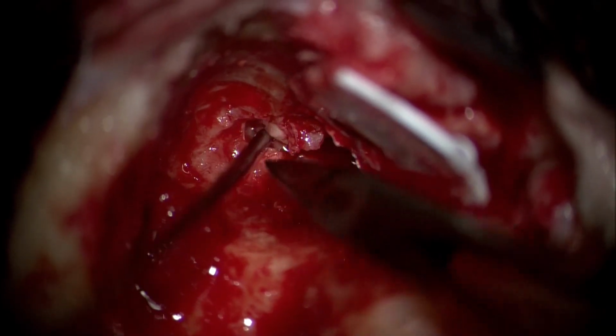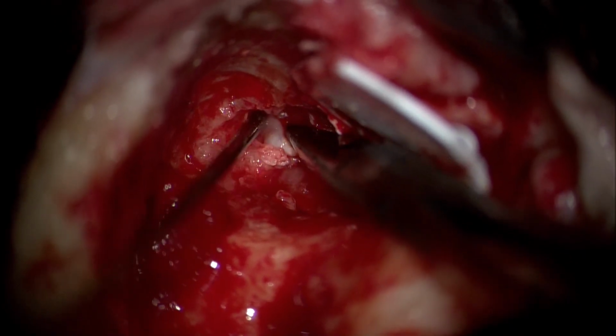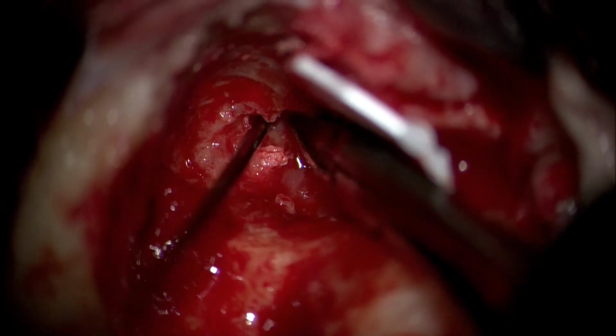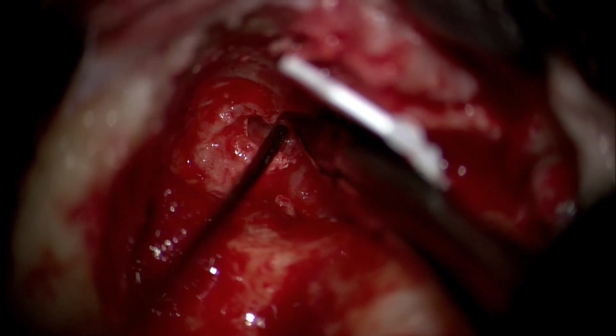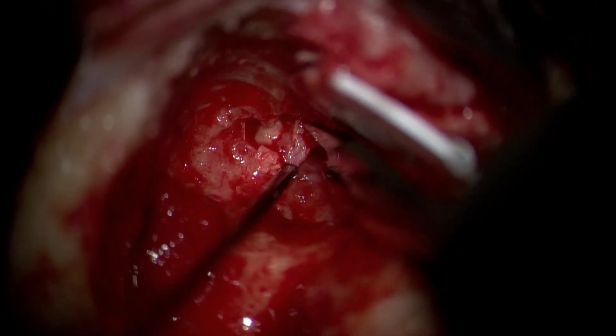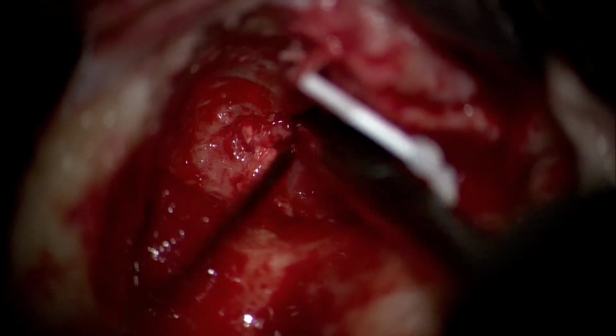Once again, using sharp dissection is of huge value in this part of the surgery, rather than using merely a blunt elevator, which often may rupture the sac and leave the diseased epithelium, or the cholesteatoma or the squamous debris, behind in this part, which could be a difficult region to track even in the post-operative period.